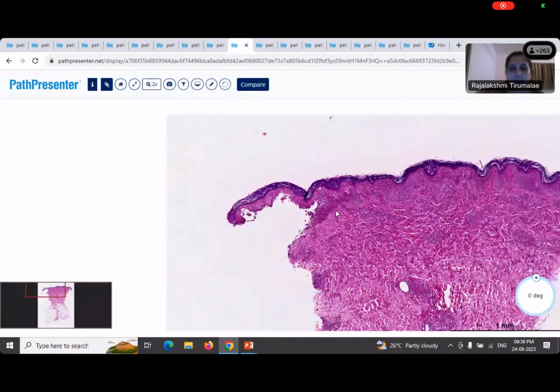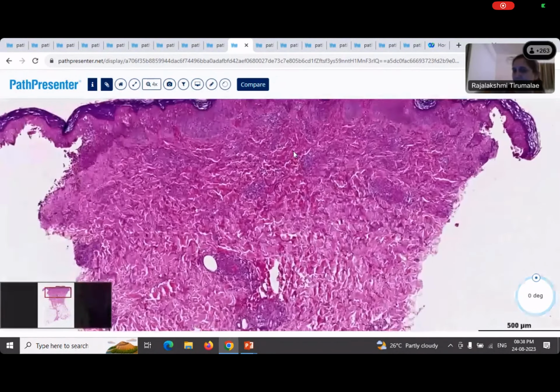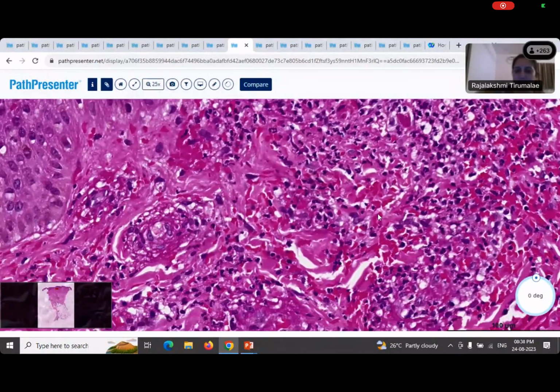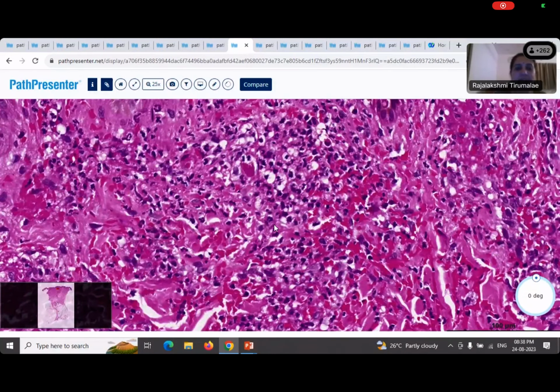Okay. Yes. So would you want to make a diagnosis? Anything else or any other finding do you think I have missed describing? I did not deliberately describe something, hoping that you will catch me. What did I miss? Neutrophilic dust, ma'am. Yeah, I never mentioned anything about the nature of the infiltrate, right? So there are a few neutrophils, and the karyorrhectic debris is not very obvious.